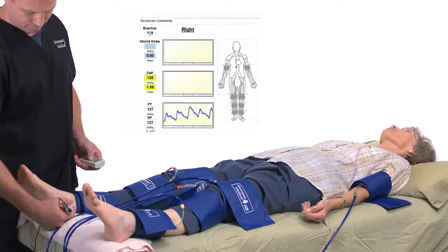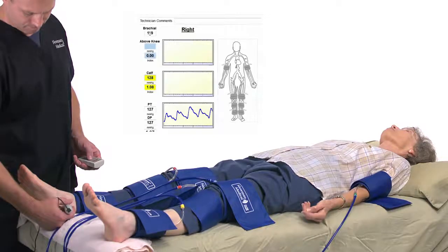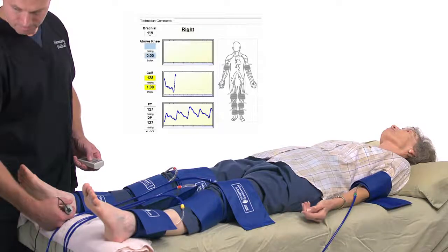Press Dump to prepare to take a waveform. Press the Waveform button and wait a few seconds for the PVR waveform to appear. When satisfied, push Next and the system will move to the above knee cuff.